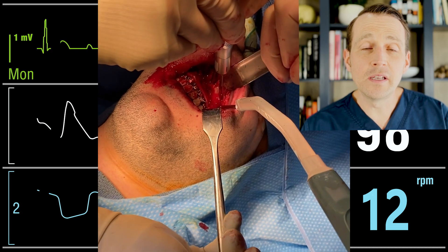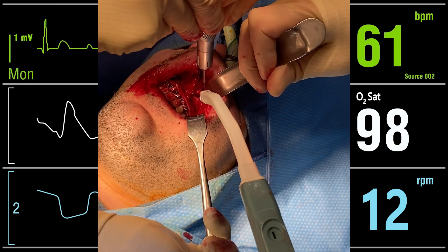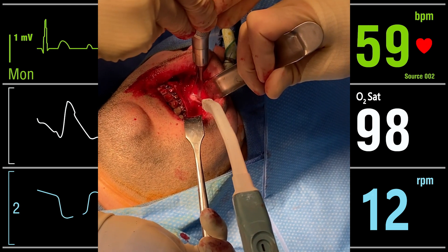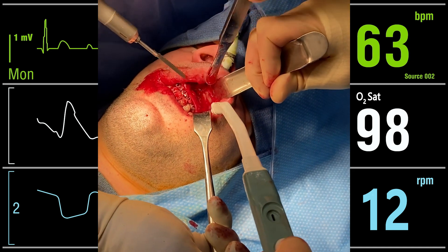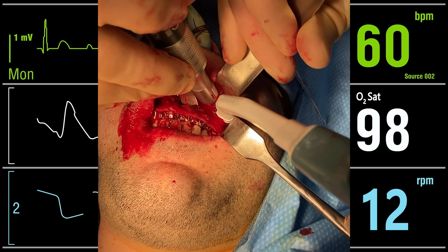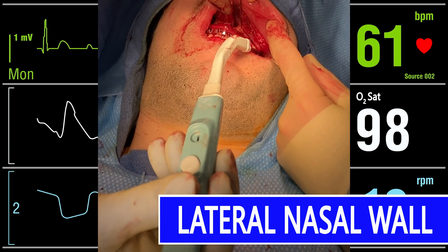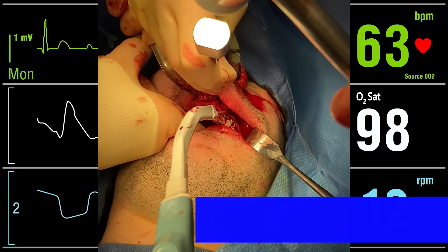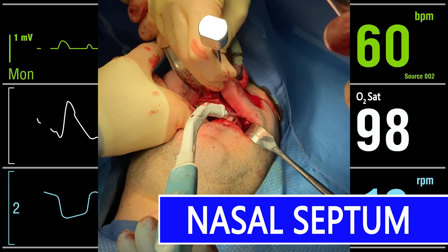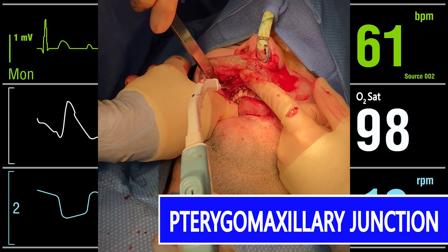This osteotomy separates the lateral maxillary buttresses and the piriform rims. I then used the guarded osteotome to separate the lateral nasal wall and also the septum from the vomer posteriorly. I used curved osteotomes to separate the maxilla from the pterygomaxillary junction posteriorly. Now it's time to down fracture the maxilla.